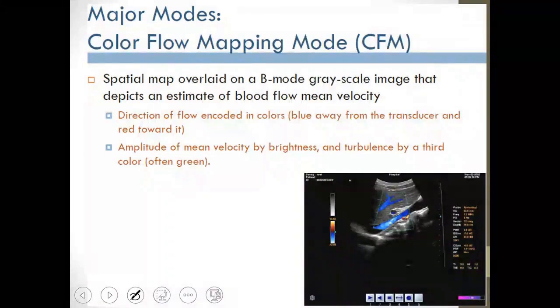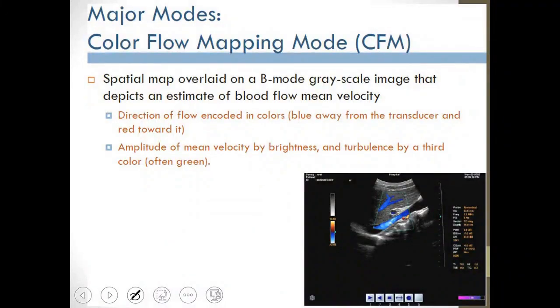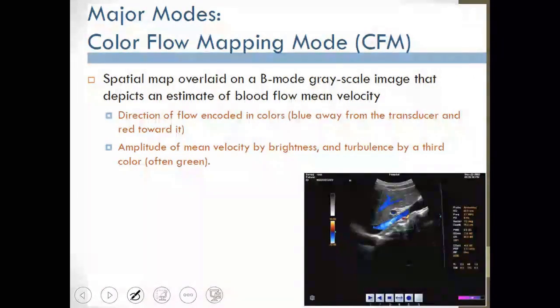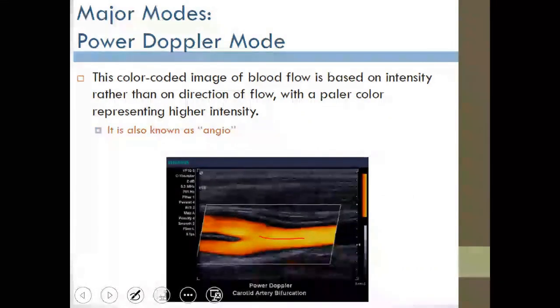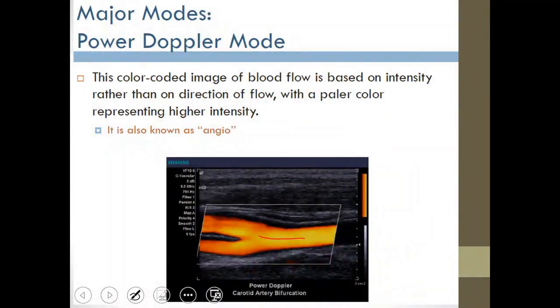For example, if you are talking about movement, you are discussing something beautiful indeed. It gets divided into degrees, and each one represents what has been received. In this way, you will find areas that are more bright and areas that are less bright. The areas that are more bright indicate that the RBCs have high blood flow, while the areas that are less bright indicate that the blood flow is low.